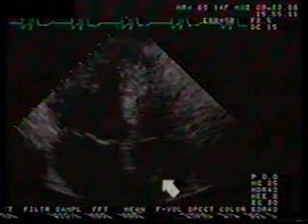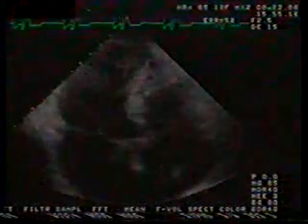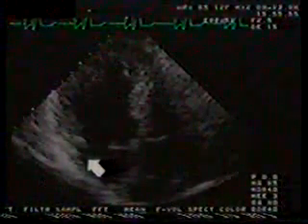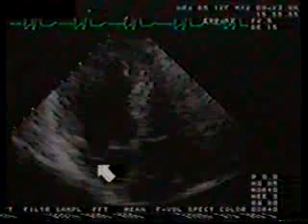This is an apical 4-chamber systolic still frame. A pacemaker wire is partially visible in the right atrium. There is bowing of the anterior and posterior mitral leaflets. As previously discussed, this is not sufficient for a diagnosis of prolapse. The transducer has been tilted slightly, unmasking this flail segment of the posterior leaflet, which hoods into the left atrium in systole. Without careful scanning of the valve, this flail segment would have been completely missed.